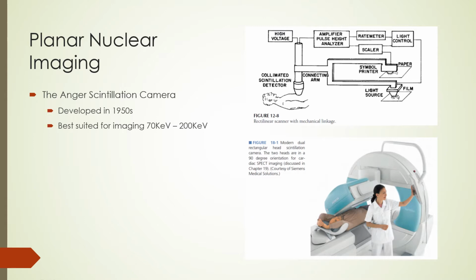Here is a brief historical note. The first scintillation camera was assembled in 1956 at the University of California by Hal Anger. Its advantage over other devices at the time, like the rectilinear scanner, was its ability to collect static data over a large area of an organ simultaneously.